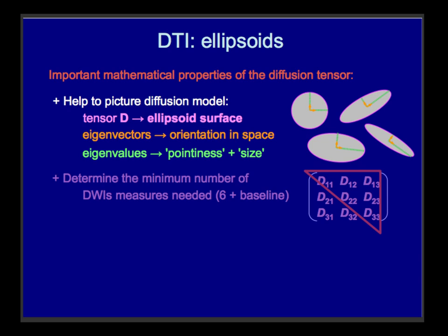And you can think about that, whereas if I gave you a cardboard box and I put a sports ball inside of it, and I said, I want you to guess what that is by poking it. You can't just reach in and poke it once and know what it is. Because if you just poke it once, you don't know whether it's spherical, whether it's a square, whatever it is. You have to poke it lots of times from lots of different directions. And the same thing is what we're doing here.